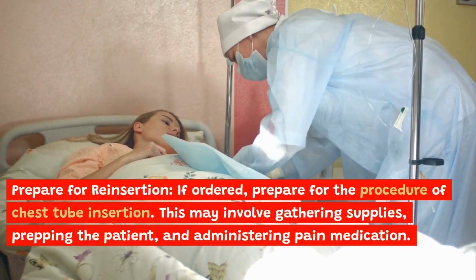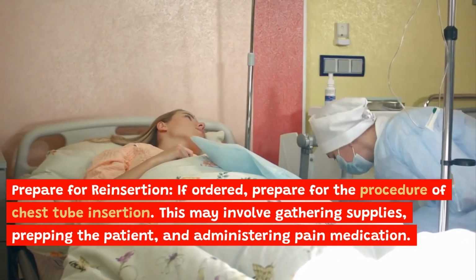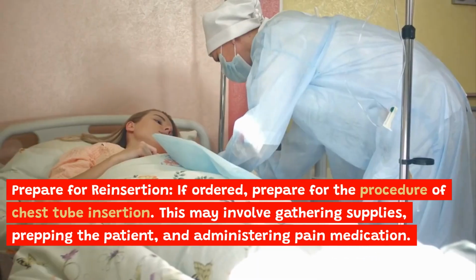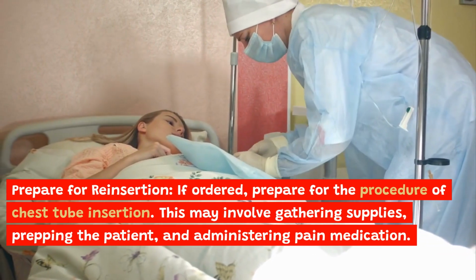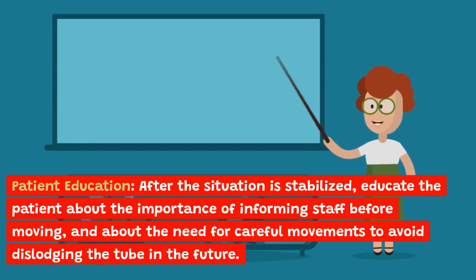Prepare for reinsertion. If ordered, prepare for the procedure of chest tube insertion. This may involve gathering supplies, prepping the patient, and administering pain medication. Patient education. After the situation is stabilized, educate the patient about the importance of informing staff before moving, and about the need for careful movements to avoid dislodging the tube in the future.